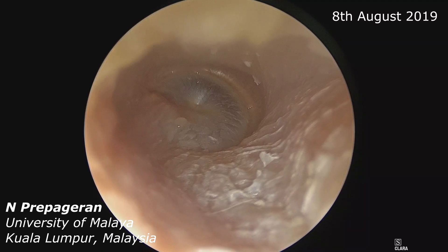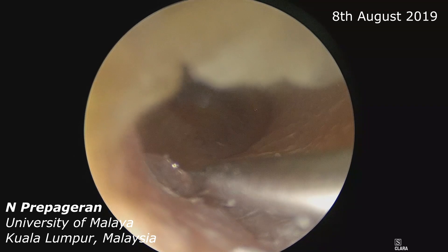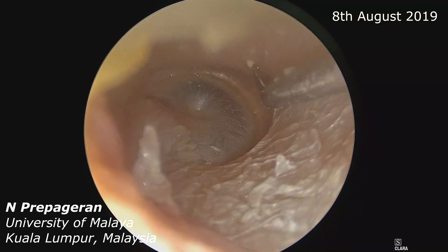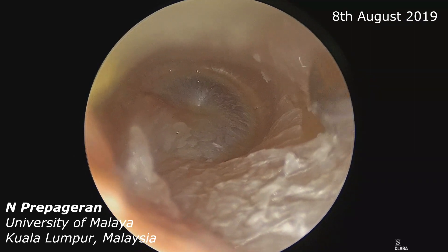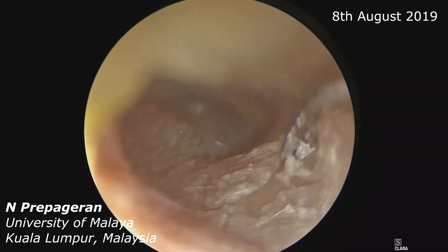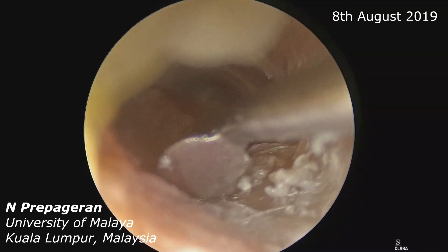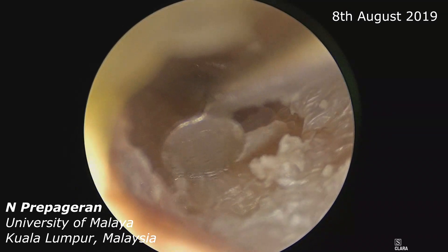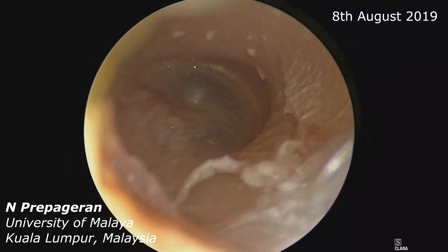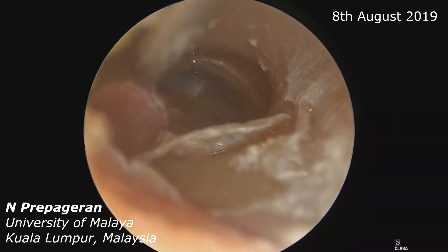The first thing that we want to do is to make an incision to elevate the tympanomeatal flap — from 12 o'clock to 6 o'clock. Once you have made the incision, it is very thin, and then you need to elevate the tympanomeatal flap.